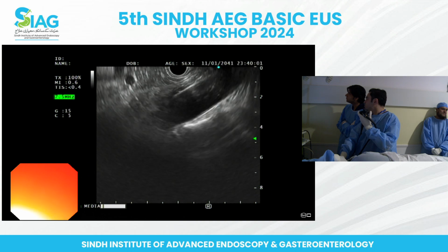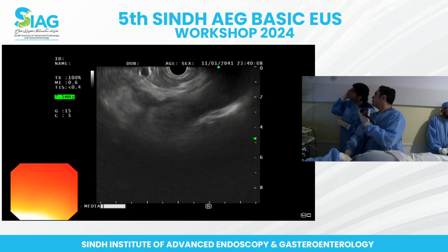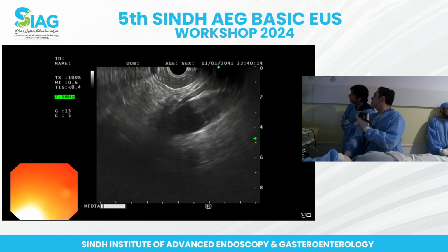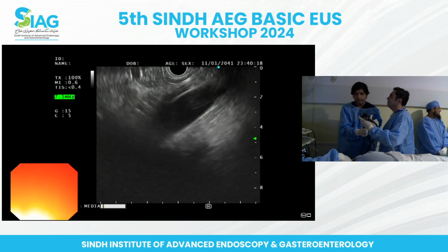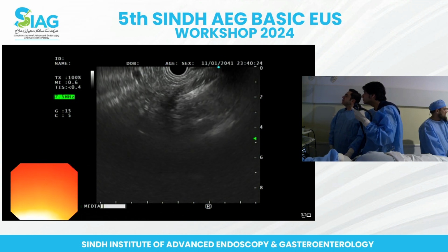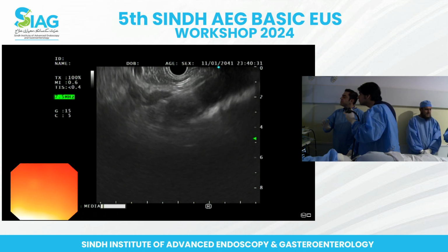So I think what you were probably doing is that the wheels were bent, and can you see that the aorta is coming up? Just try to simulate that again. Okay, so have a look at the aorta. So just clockwise torque. Clockwise torque, yeah, excellent. So that's the aorta coming up, okay? So he is a very large chap as well.